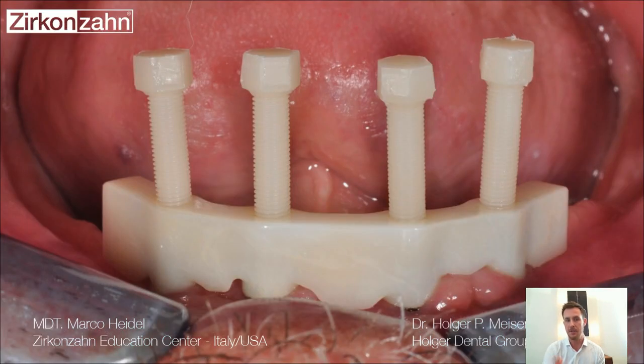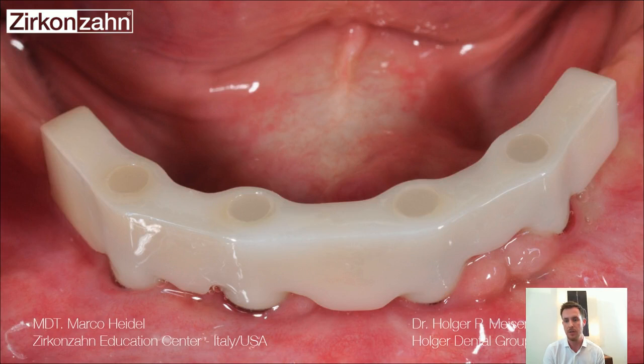And this is also a smart solution I want to show you in a few seconds to close the screw channels. Yeah, those are plugs milled in resin to close the screw channels in this way. Just let you know in a few seconds. I hope the video does work right now, because I got a video from the patient himself to explain his situation.